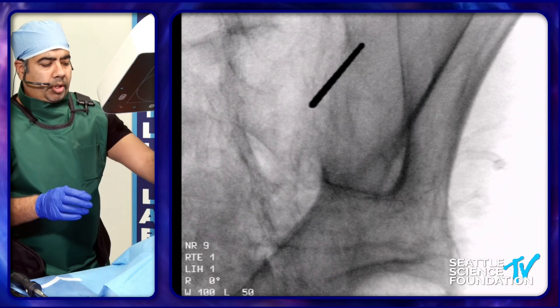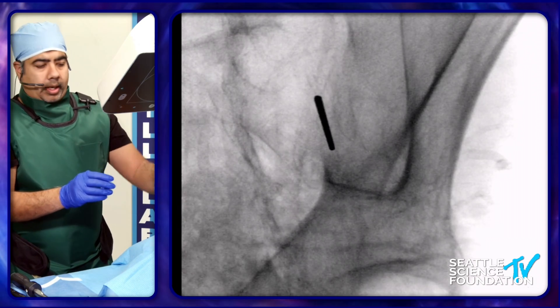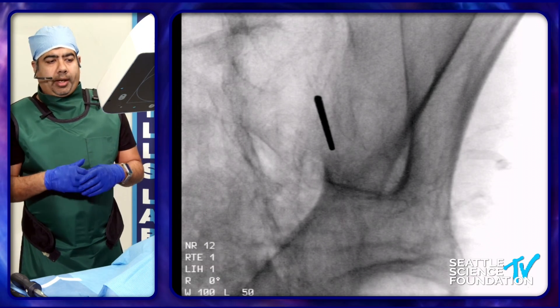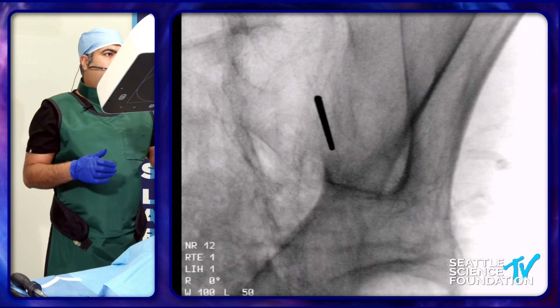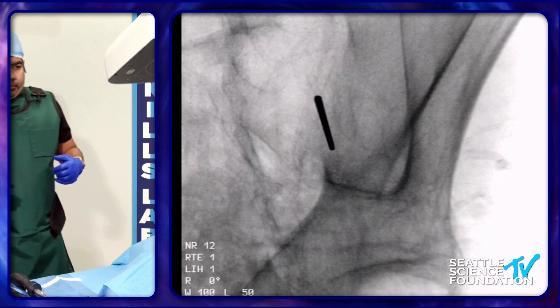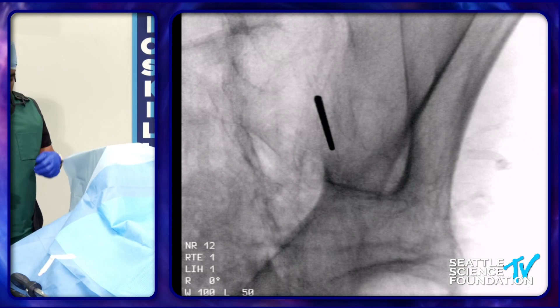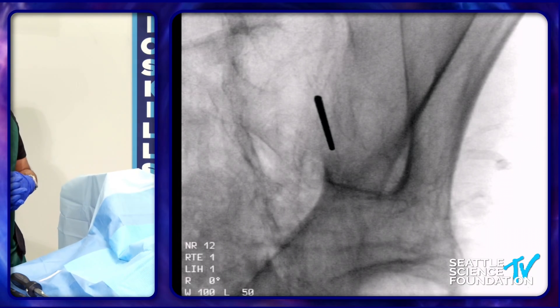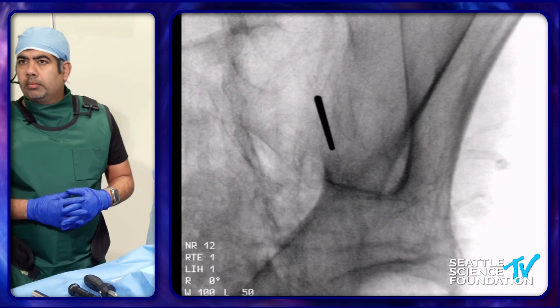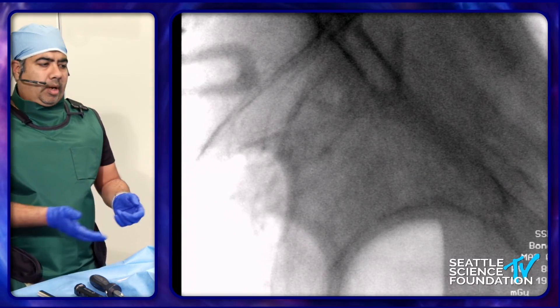The key — really the majority of the procedure — is basically placing this Steinman pin in the right spot. Once you get the feel that your Steinman pin is in that SI joint line, we'll go back to the lateral view so we can look at the belly of the sacrum and the SI joint from the lateral view.